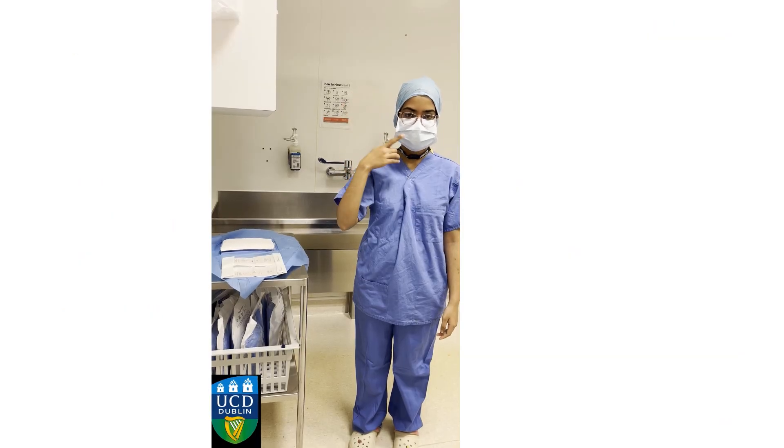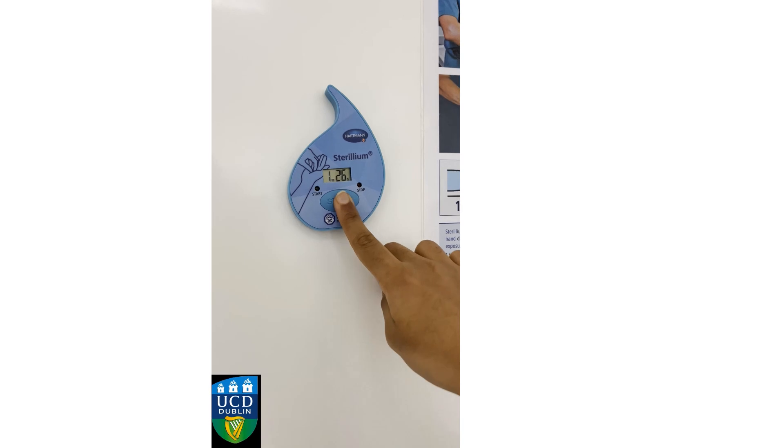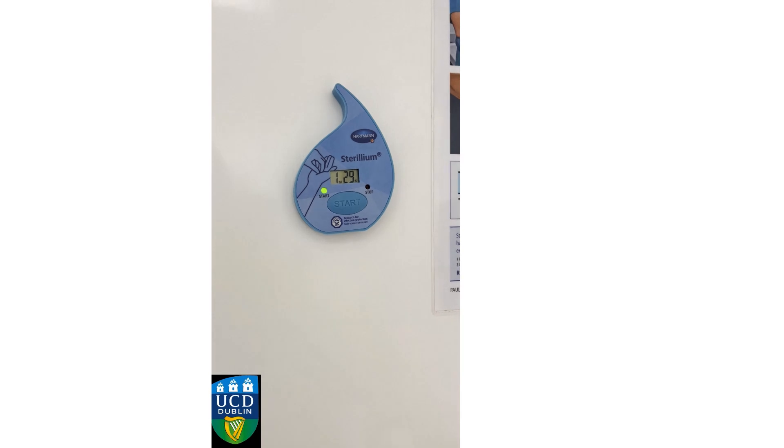You should be wearing a scrub cap, face mask, scrubs, and clogs. Here is a poster of how to use the sterile gel as a memory aid. Then turn on the timer mounted on the wall. This is one and a half minutes of hand sanitizing.